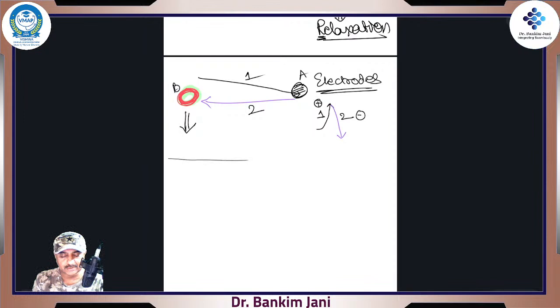What would happen? It will take a direction. First, it is going away, so for B it would be a negative deflection. And two is coming towards it, so it would be a positive deflection, right? So whether positive or negative, it is not at all with respect to what is happening to the heart. It is just that the electrode is watching from that angle whether the current is coming or going.